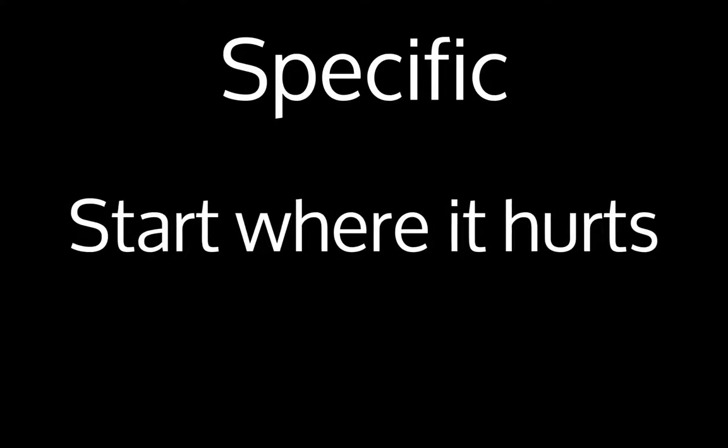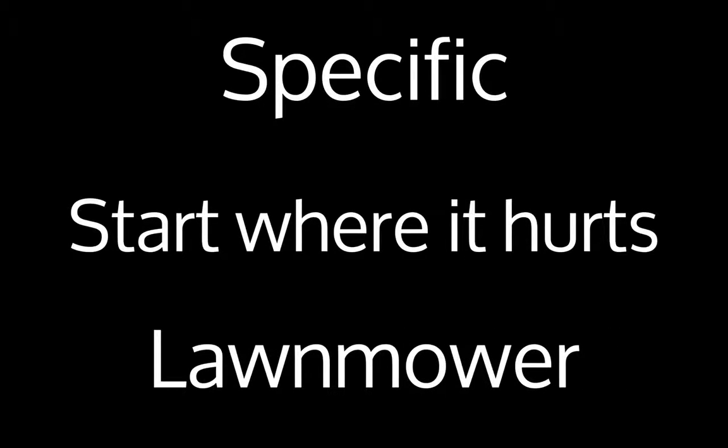Don't forget that your ultrasound examination is very specific but not sensitive. So if you see an appendicitis, the patient probably has it. But if you don't see it, it doesn't necessarily mean that they don't have it. Start by asking the patient where it hurts and put your transducer right in that area. That's where I've had the most success. If that doesn't work, you might need to go up and down the iliac artery or just lawnmower that whole right side of the abdomen.